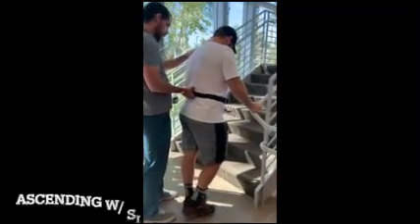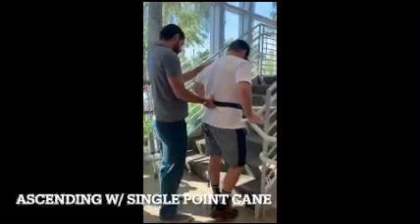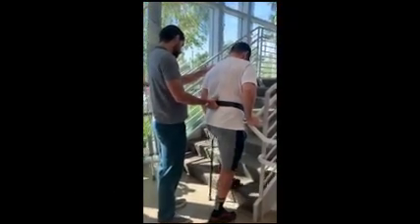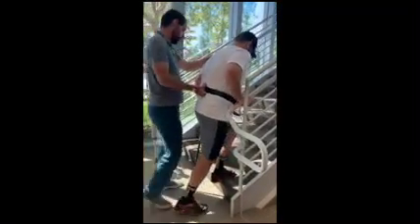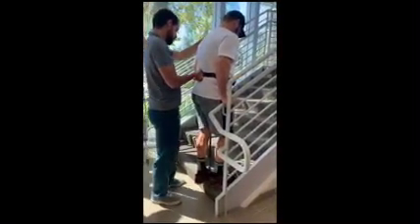I got my outside hand on his shoulder. You're going to go up with your unaffected left leg first, and then you would do the foot next, and then the device, or you can do them together. So we're going to go left foot, and then right and cane together. Left, right and cane together. Left, good. Left, left, left.